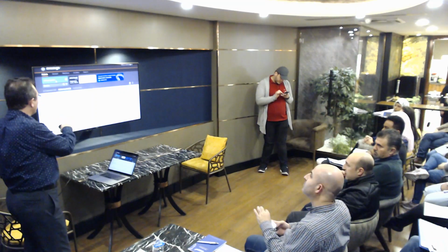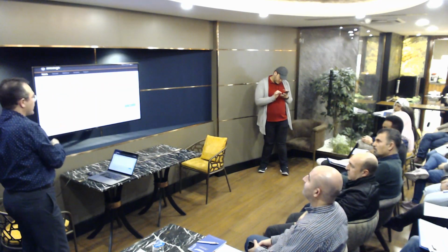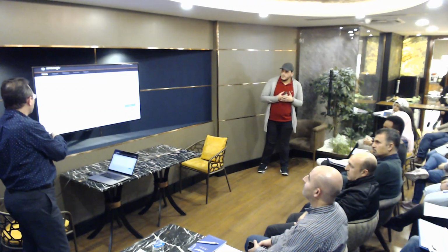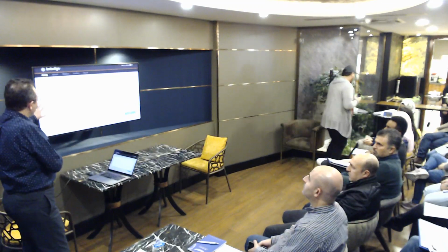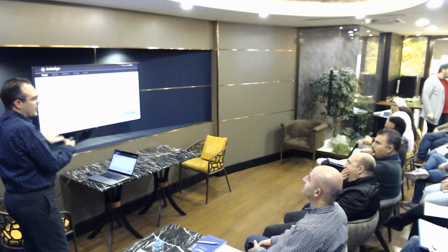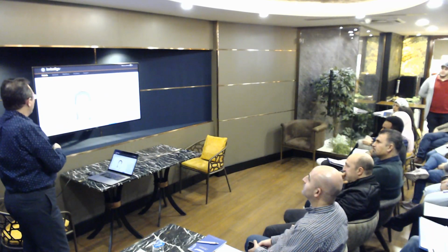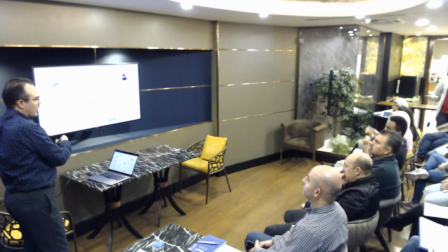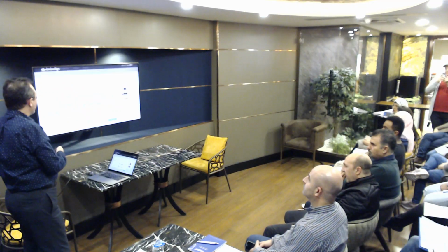You log into your account, you have the list of the patients, you just add a new patient, and then you start filling up the data. Once you do that, the name, the last name, the gender, and the date of birth, then you move to some information about the case. What are we dealing with? Crowding, spacing, class 2, class 3. This is for future reference. We upload the patient's photos. It's either one by one or you can use the template. I prefer the template because it saves a lot of time. So I prepare the template, I upload it, I upload the X-ray, it's ready.